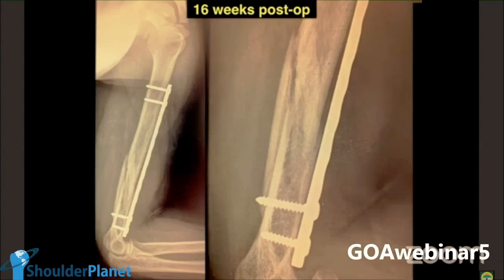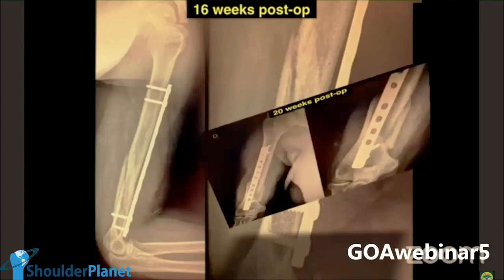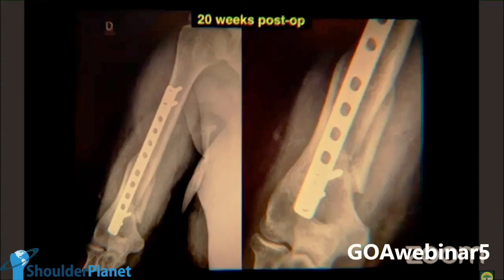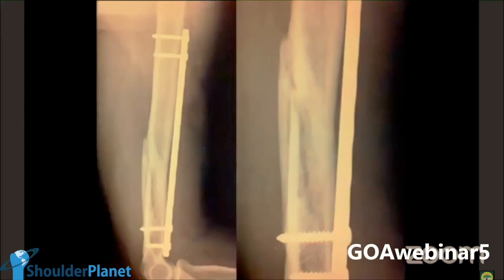I'm going to show you guys. So you see 20 weeks. See on the right side, lovely mature callus is forming. And if you see this in 2 more months, it's going to be better. 5 more months is going to be better. But this lady, she said to me that day, I am perfect. I have a small baby. My husband, he works a lot. It's difficult to come here. Please discharge me. She's very nice. So I did it, and a lovely image on the left view. And this is going to remodel for still a lot of time.